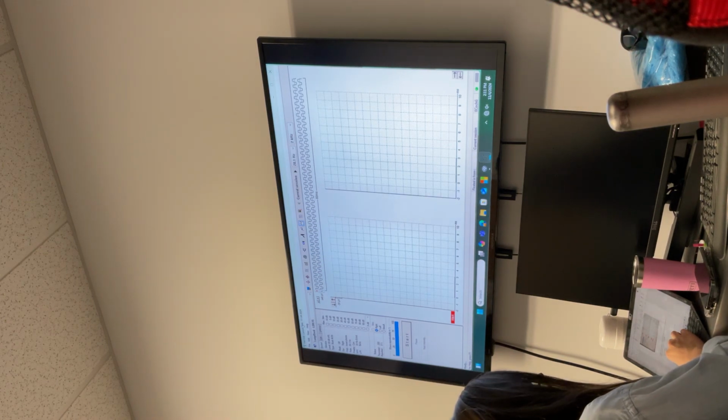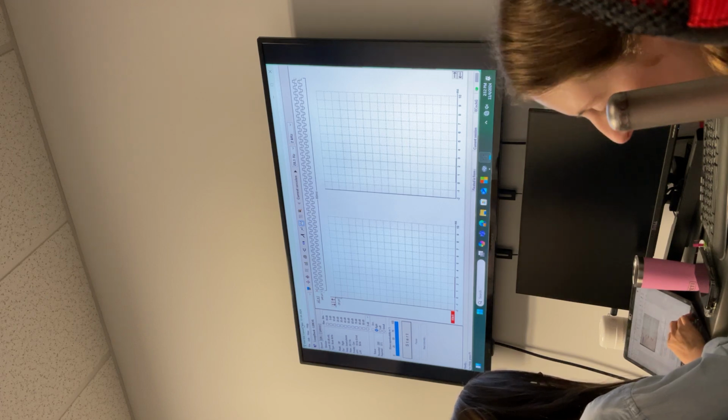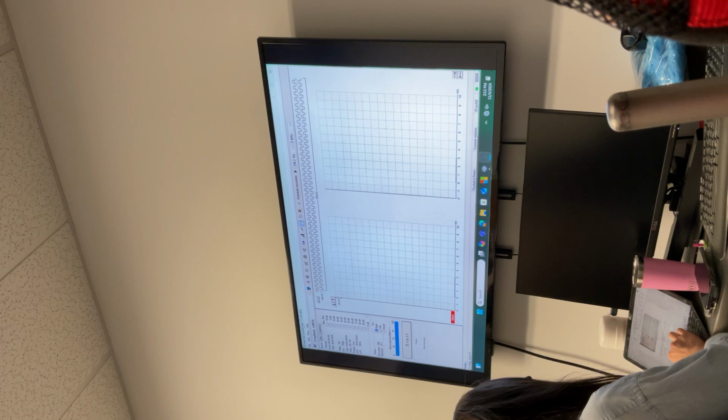I think, let's see, whether I want to use tone burst to measure ABR or chirp. That's the decision you have to make, lab 5 and 6.